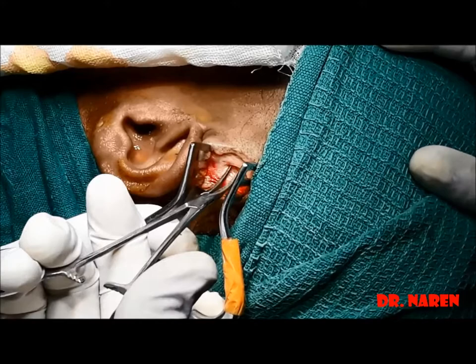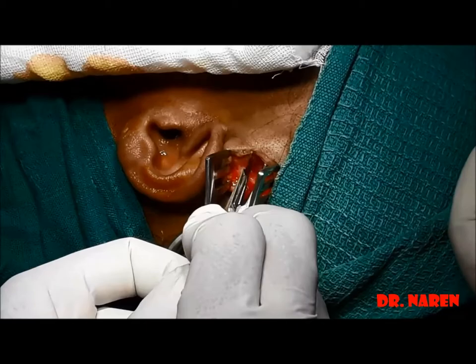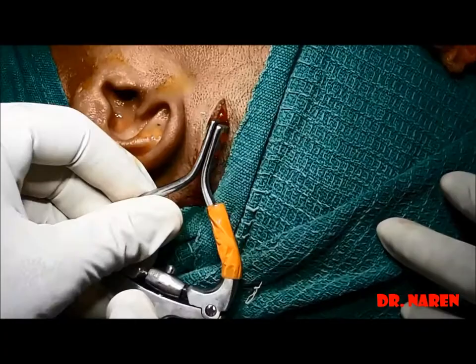The next layer we are going to dissect is the auricular muscles. Both anterior and superior parts will be coming over it, and we can just dissect it to attain the next layers. You can see the dissection is made out here, dissecting the auricular muscles.